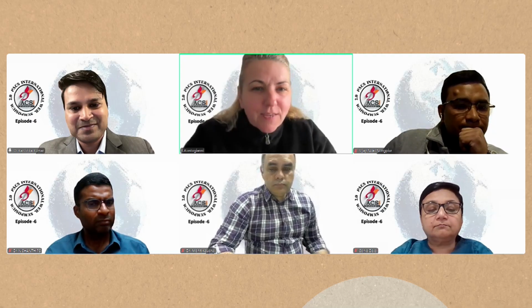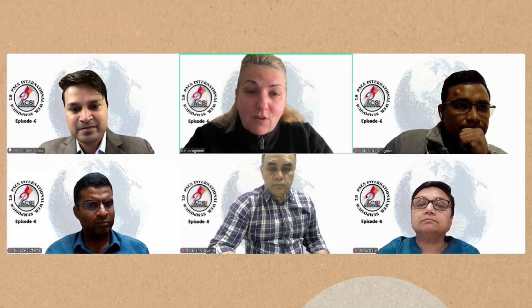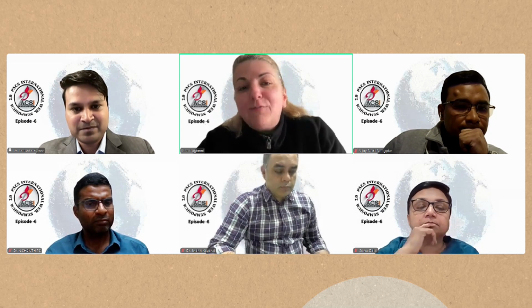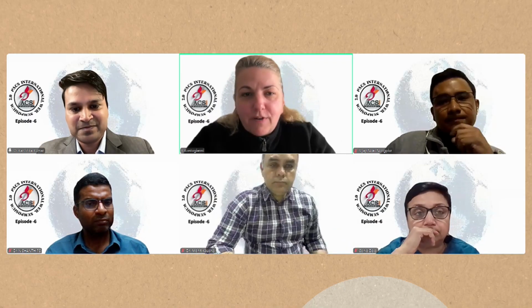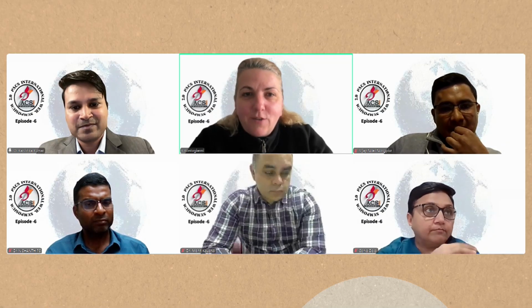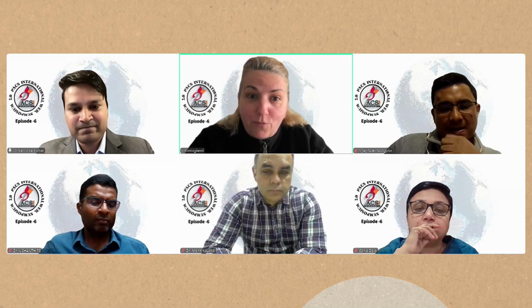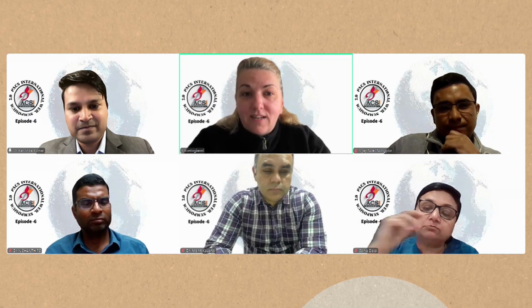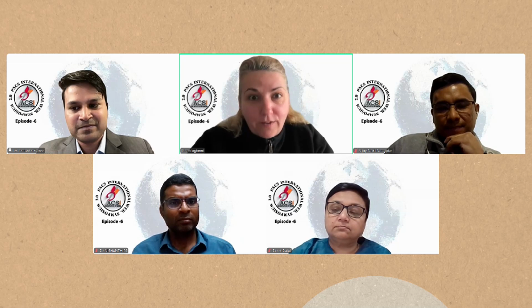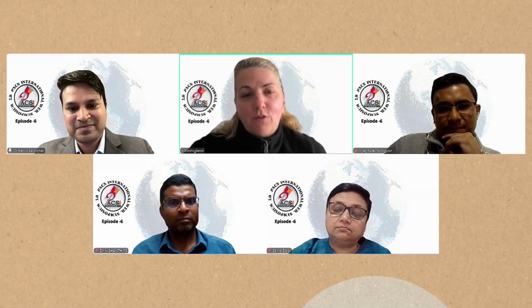For us, emergencies are life-threatening conditions, of course. You have to be quick, you have to be effective, and you have to have a plan B. These are the three most important pieces of advice that I have from my experience in everyday bronchoscopy. It can happen without warning, and then you have to really have a plan in your head. And also the nurse has to have a plan. The nurse in the room is an extremely important part, an experienced nurse who knows which tools you will be needing, who knows where they are, because time is really important. These are the keys of successfully dealing with such a situation.